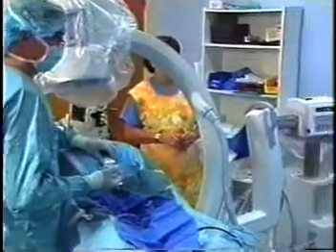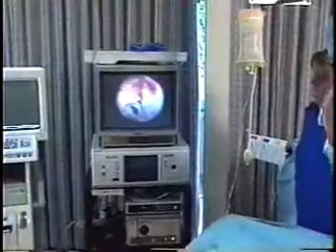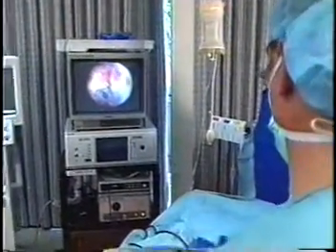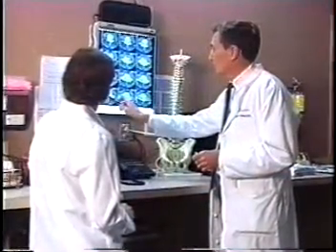Spinal endoscopy is a safe and effective method for treating patients with chronic low back pain and leg pain arising from certain types of conditions or injuries. The EBI ViewCath spinal endoscopy system is a valuable device for your physician to use in your medical treatment plan.